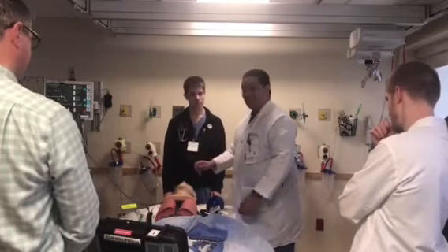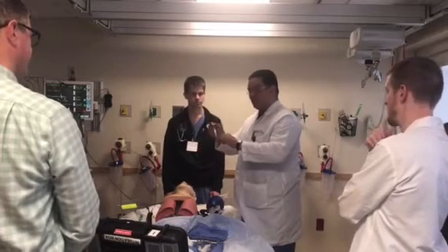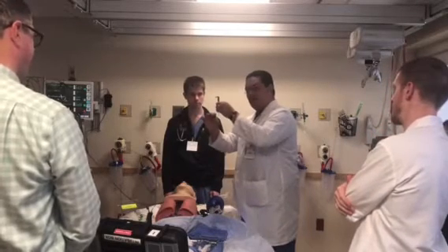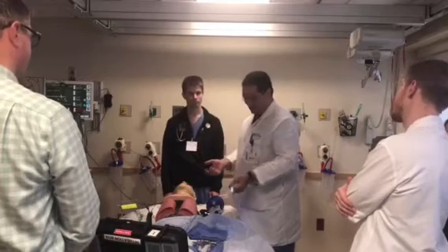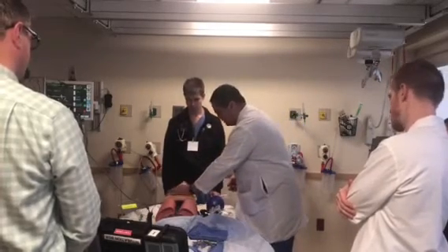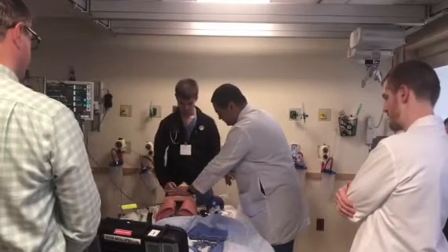Let's fish for something. And whatever something hangs on, you just pull it as hard as you can, as if you're trying to get the mucosa of the larynx close to the skin. Very medieval. I don't know what anybody does. Very simple, like we talked about before. You hold it like this.